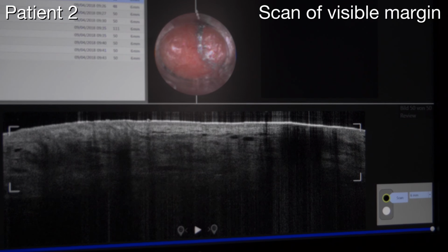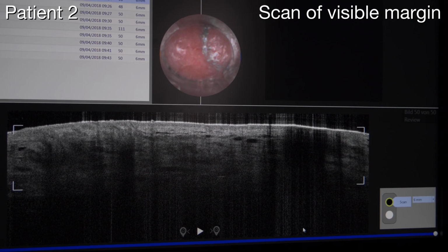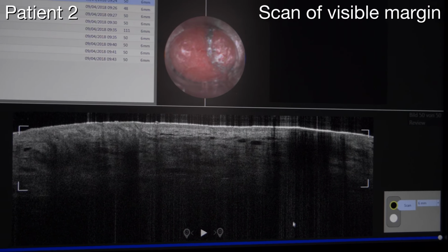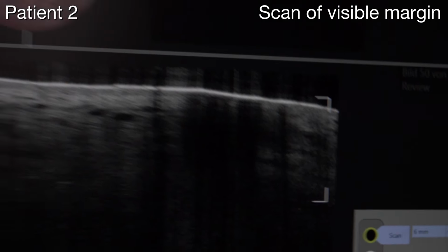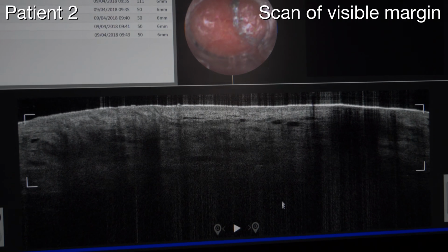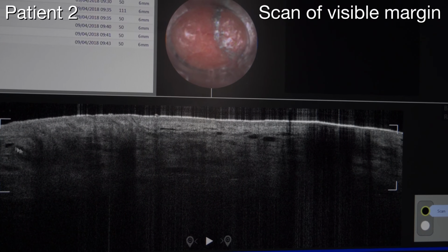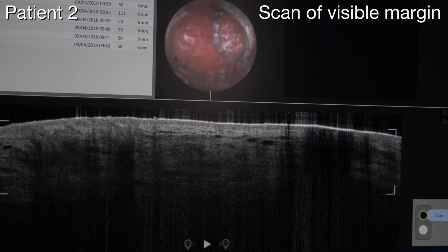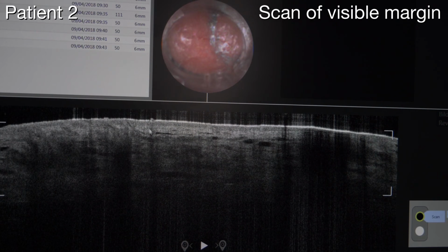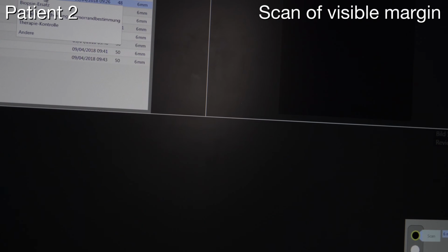And here we have also the demarcation of the pen, and here we have the shadow of the pen. So this is starting the scan at 12 o'clock. Okay. And we could imagine that this might be a nodule, but I'm not 100% sure. And here in this field, this is healthy skin. We just see a lot of blood vessels here, the dark structures here, and also the longish ones here. But we don't see any tumor cells or protrusions from the epidermis. And then we go on to the next image.